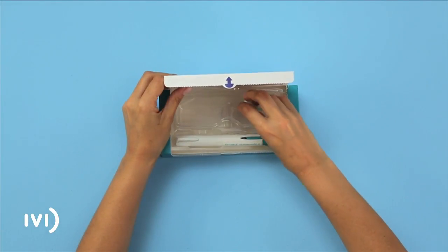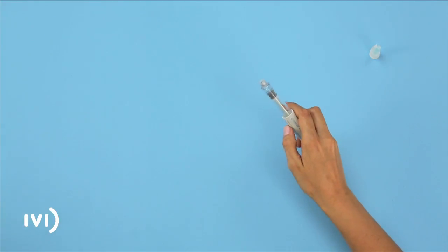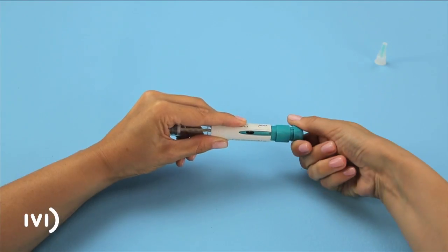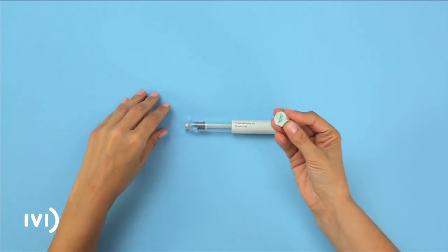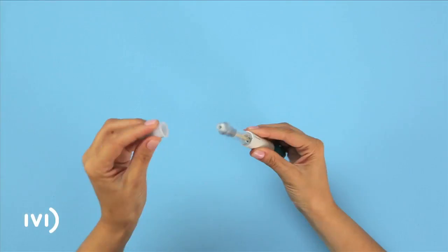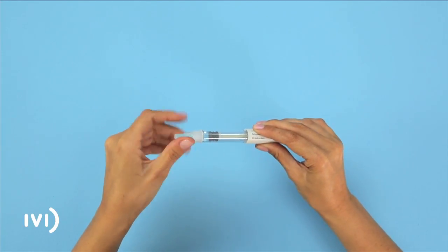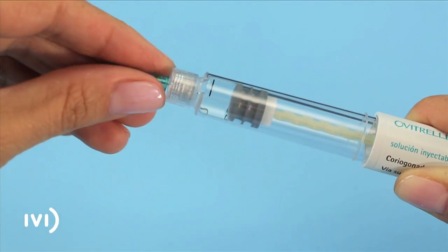Open the box and remove the contents. Take the pen and remove the cap. Turn the dosage dial in a clockwise direction until the display shows 250. Take a needle and unwrap it. Next, attach the needle by screwing it onto the end of the pen.